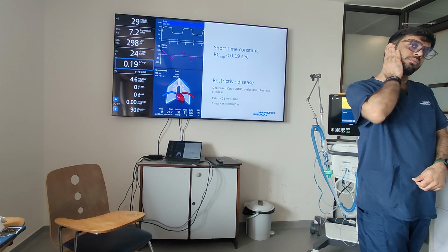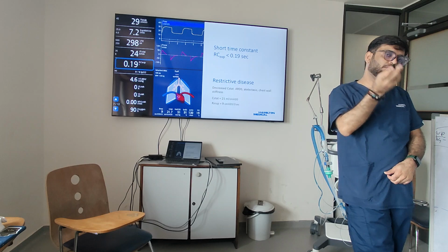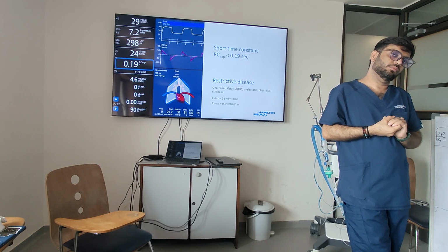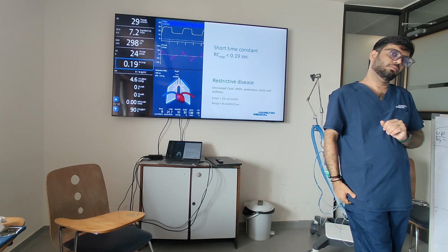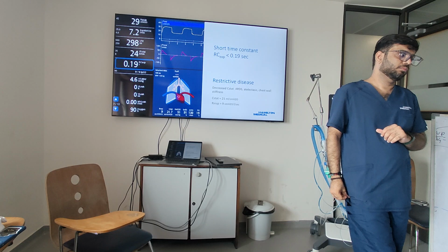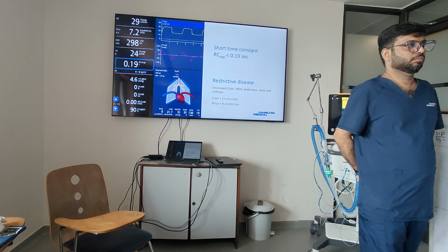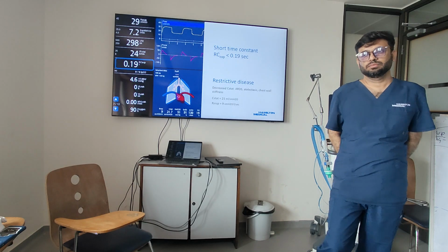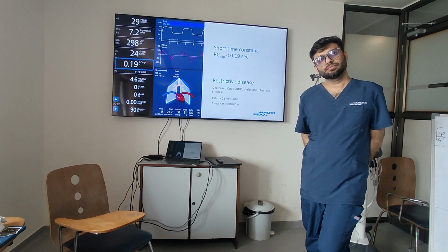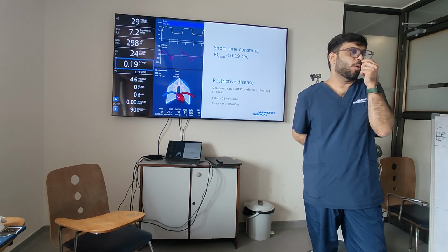It will affect ETCO2. Yesterday, that patient had an ETCO2 of 22, 23, and an I:E ratio of 1:6 like that. So that depends on what mode you see. If you see IntelliVent, I mean fully closed loop, then it will decide based on what target you have set. If you have set a target of 25 to 35, you can keep it at 25 to 35. If you have 35 to 45, keep it at 35 to 45. It will do everything to move toward that.